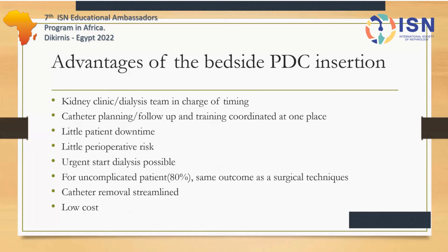Again, if you compare to the surgical technique for patients who are uncomplicated, the outcomes are similar. And the other advantage of the bedside PD catheter is cost. It's done by nephrologists. You don't need to look for the surgeons, the anesthesia team, look for theater space and then recovery and all those things.